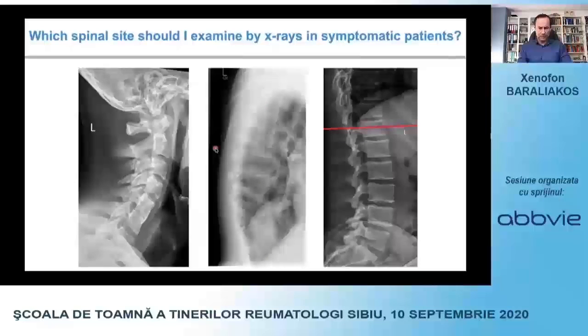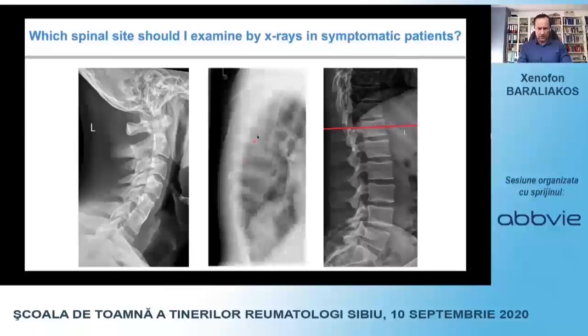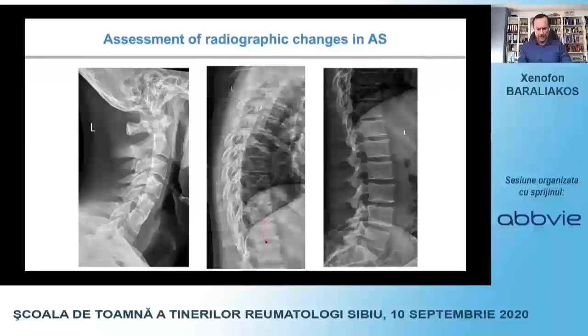And this is important because also in the X-ray changes that we obtain, we may not have been able so far to check the thoracic spine so nicely. That's because of the overimposed lung tissue, we have not been analyzing the thoracic spine so much. Nowadays, we can include the lower part of the thoracic spine in the X-rays, or by applying digital imaging, which I suppose you may also have in some of the institutions.